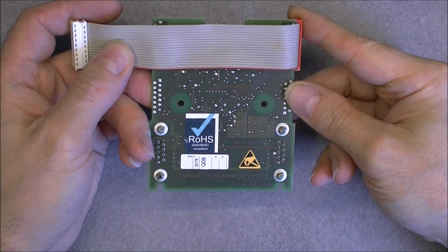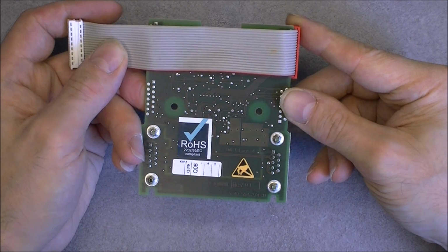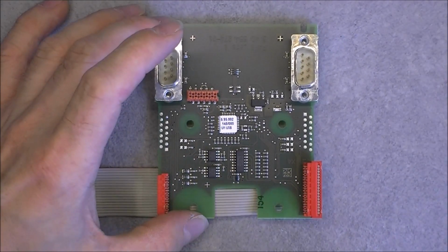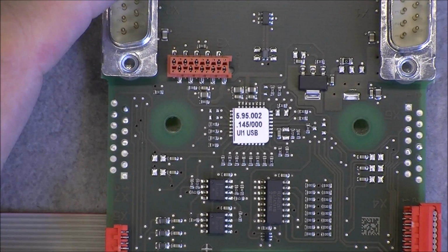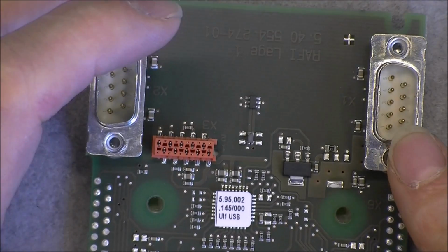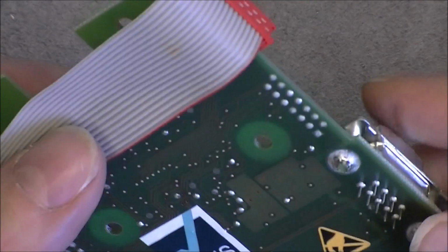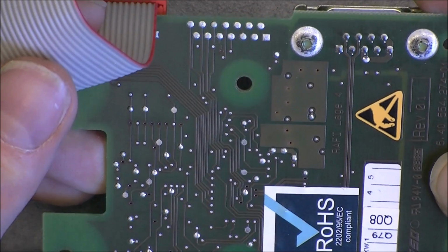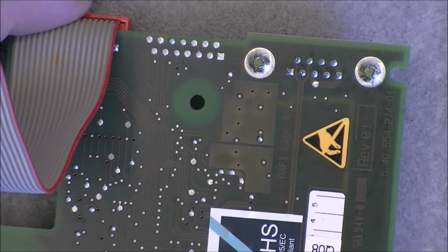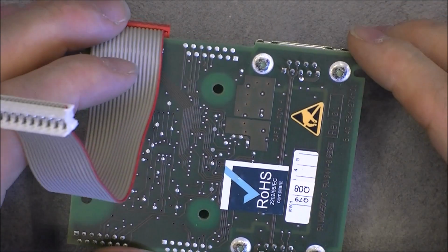So it is written RoHS compliant. We have version number and such, static sensitive. And here we have in fact a very little bit of electronics. And look at this, guys. On this chip it is written USB. This is very interesting, but as you can guess, connecting USB to a 9-pin plug is not standard. So it will require a little bit of reverse engineering to figure the pin out. If it is really USB, so I have no idea if the other parts are also USB or some other protocol, but this is interesting.